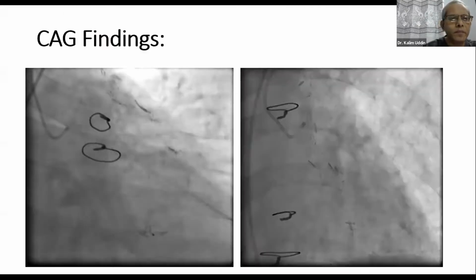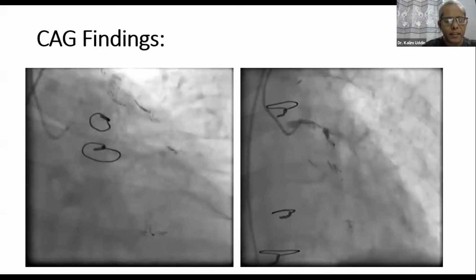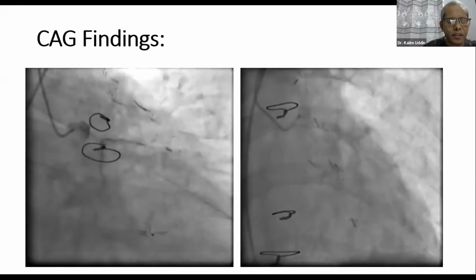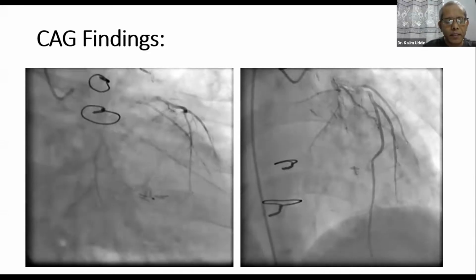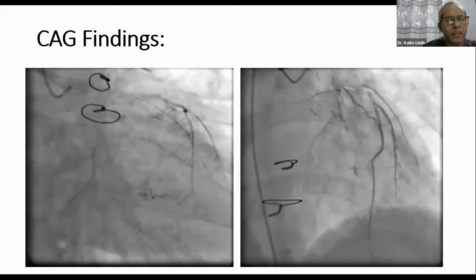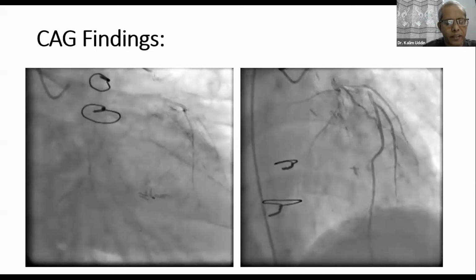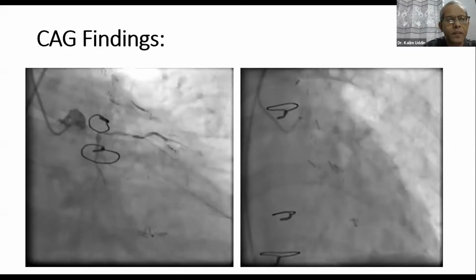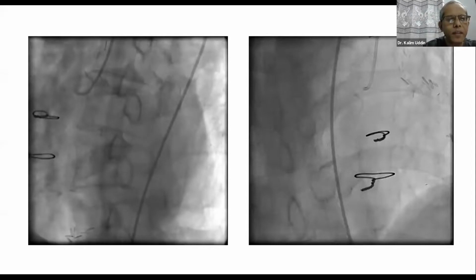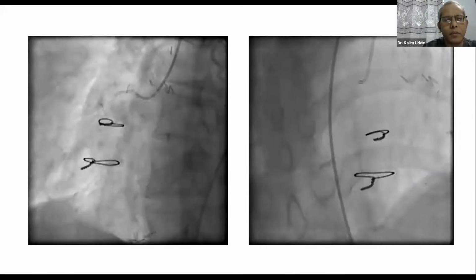Coronary angiography shows 80 to 90% stenosis in the distal segment of the left main coronary artery, 70 to 80% stenosis in the proximal segment of LAD, OM1 totally occluded at its ostium, LCX free of significant disease, RCA dominant vessel having 80% stenosis in the mid segment, and PDA totally occluded in its proximal part.